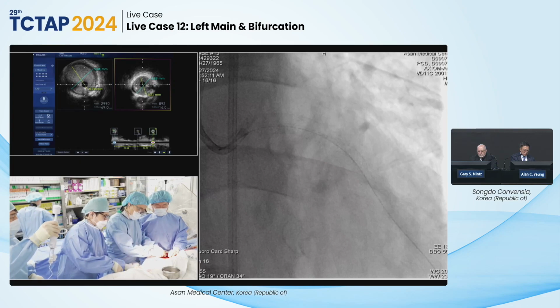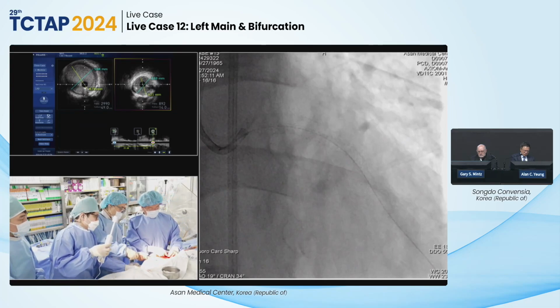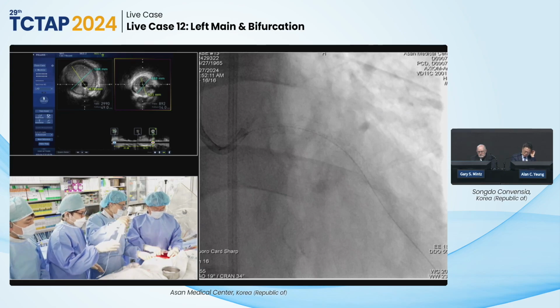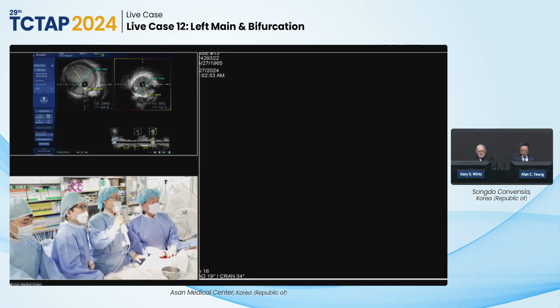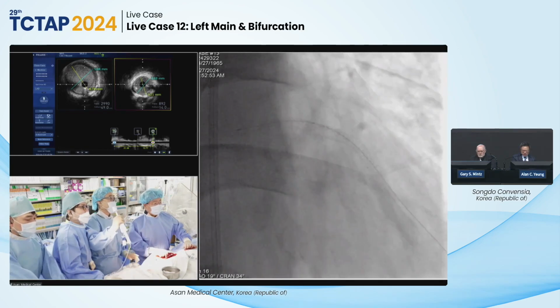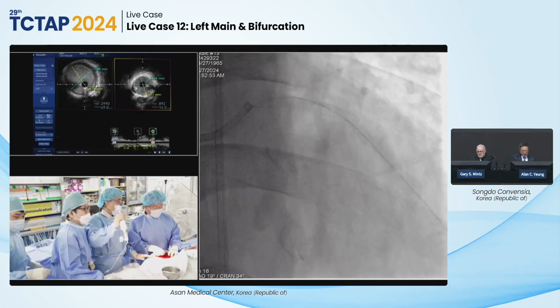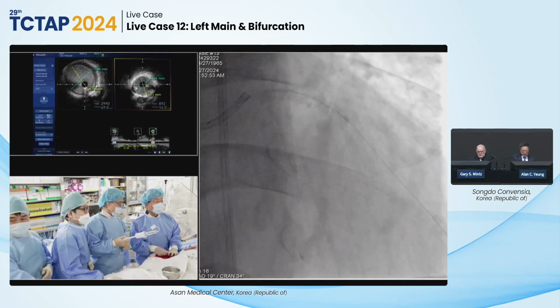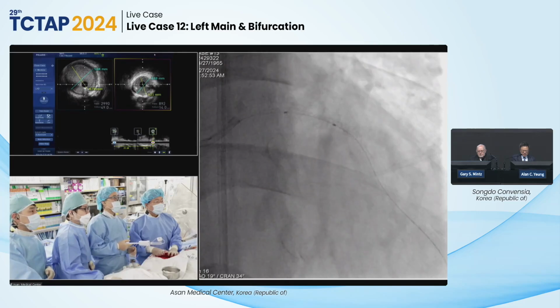Any opinion from the panel on using plaque modification pre-dilation, like a cutting balloon, scoring balloon or Shockwave? Usually we just use the non-compliant and regular semi-compliant balloon and prep those areas. It was not completely concentric, and I don't see any reason to use lithotripsy or IVL or anything like that, just adding to the cost of the procedure.